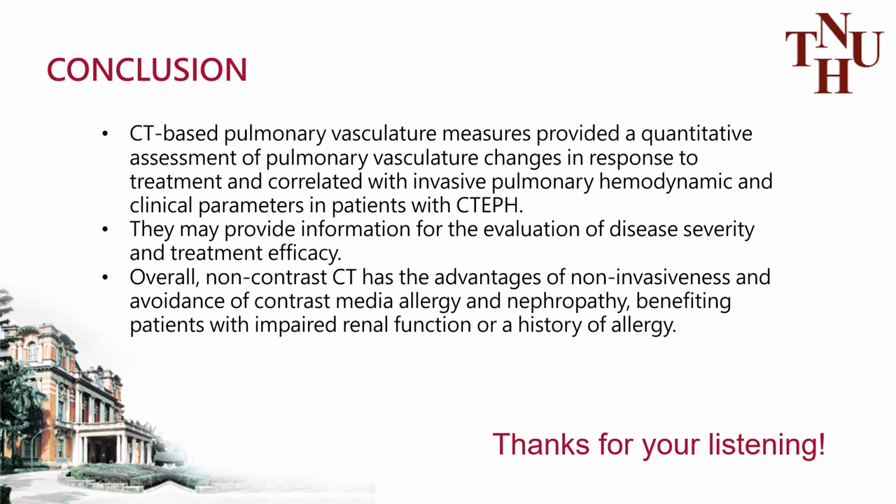Overall, non-contrast CT has the advantage of non-invasiveness and avoidance of contrast media allergy and nephropathy, benefiting patients with impaired renal function or history of allergy.